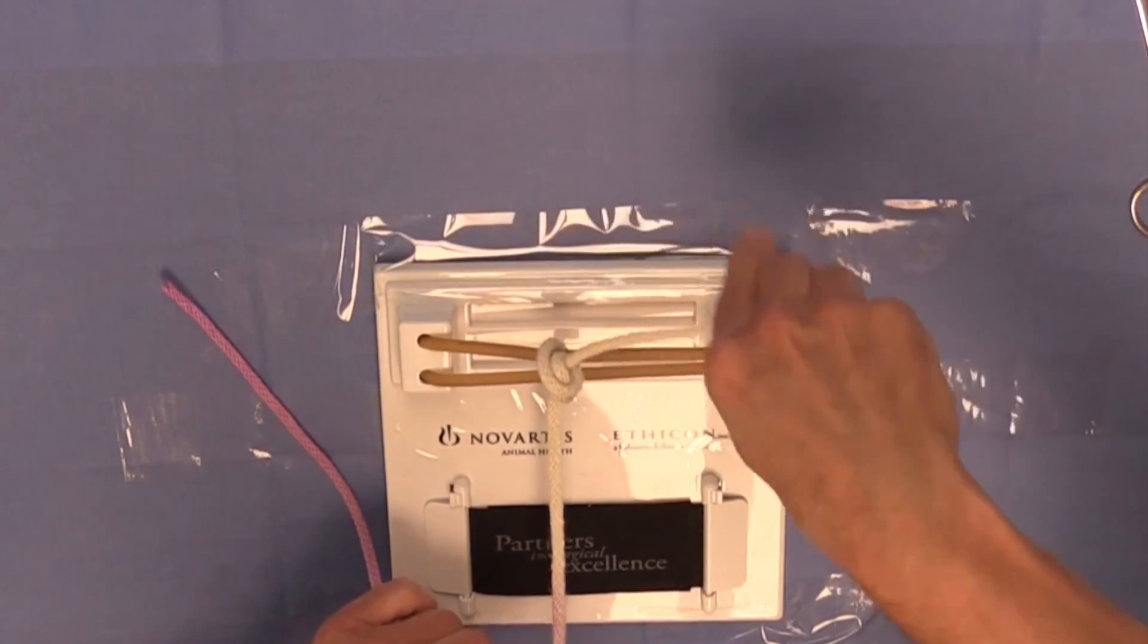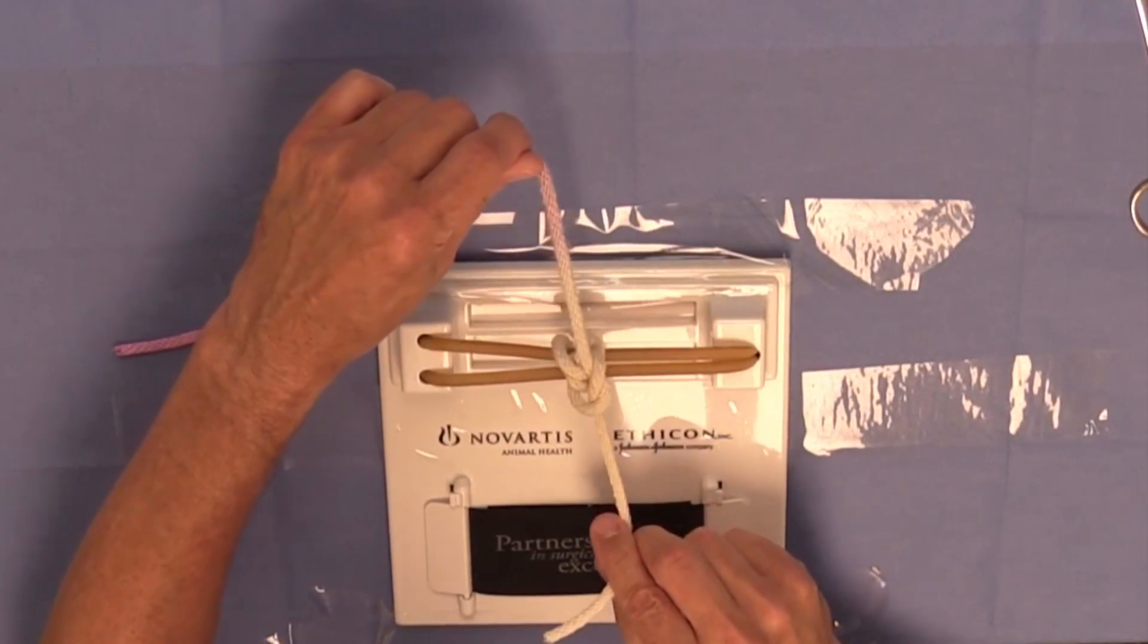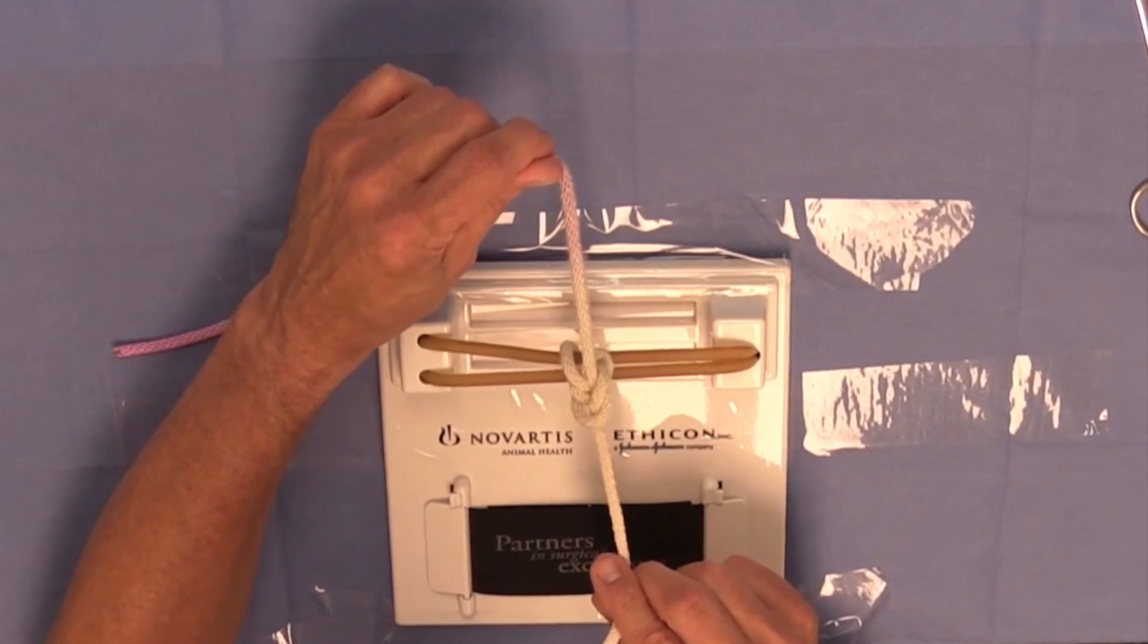Okay, then I'm just going to simply use a surgeon's throw, a simple throw, and now I've completed the surgeon's knot using a one-hand technique.